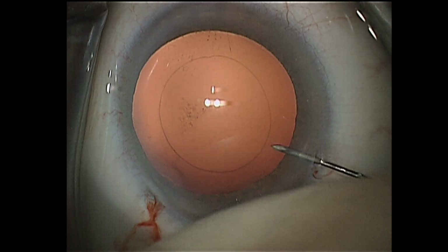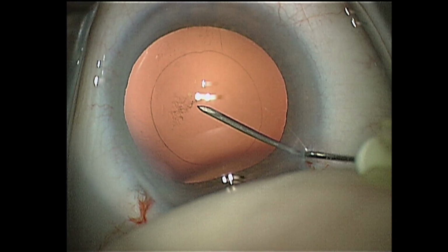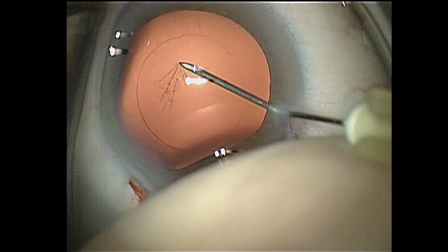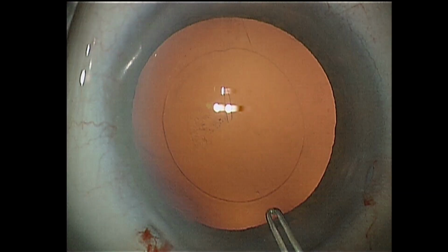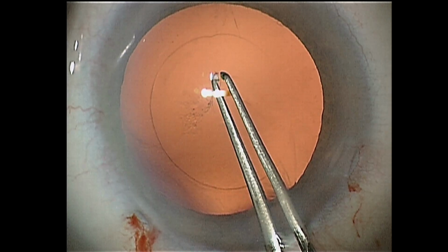Then a 30-gauge hypodermic needle, bent bevel up, is tangentially approached to the central capsule, aiming at lifting up a fold and then perforating it. Other than usually taught, OVD is not yet injected through the slit created.